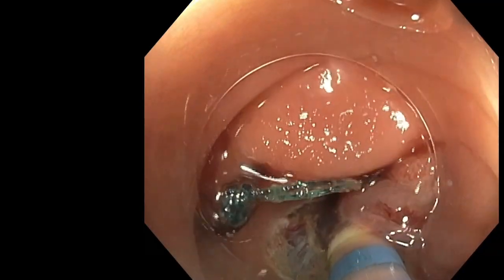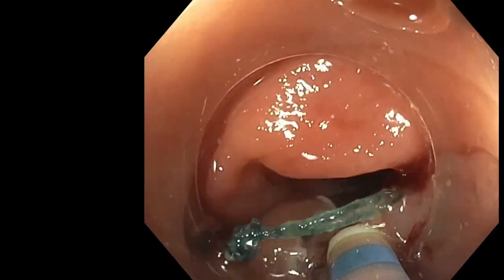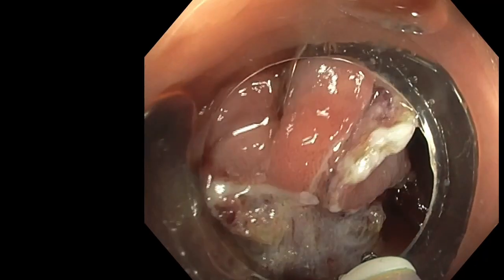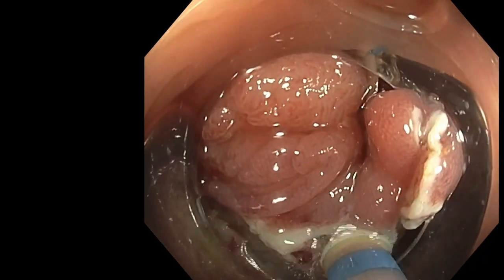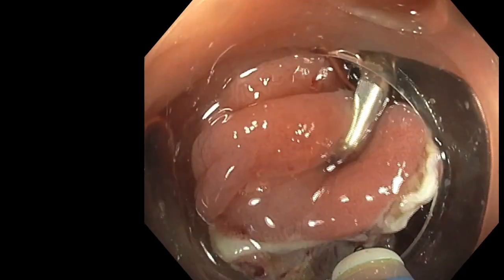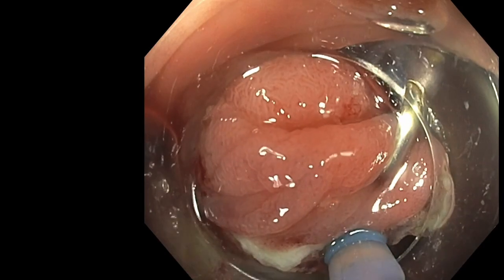Here you can see really good exposure. We see really where are the submucosal fibers, but we should go slowly to identify the muscle layer and be sure we will not damage it while cutting the submucosa.